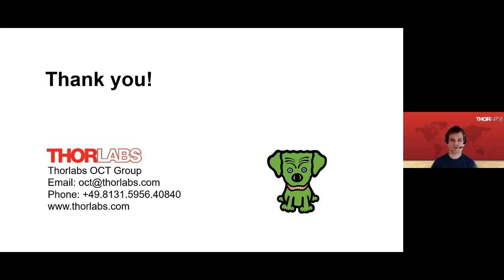Yes, theoretically, swept source OCT can get the same resolution by using the same bandwidth. It is just technologically a lot harder to get multiple swept source lasers to work together. And in spectral domain OCT, it is really simple. You just take one SLD and another SLD, and you use a fiber coupler to couple them together to get one broad spectrum. So it is mostly a technological limitation, in the sense that it is just much harder to do it. So usually people use spectral domain OCT when they want a high resolution.